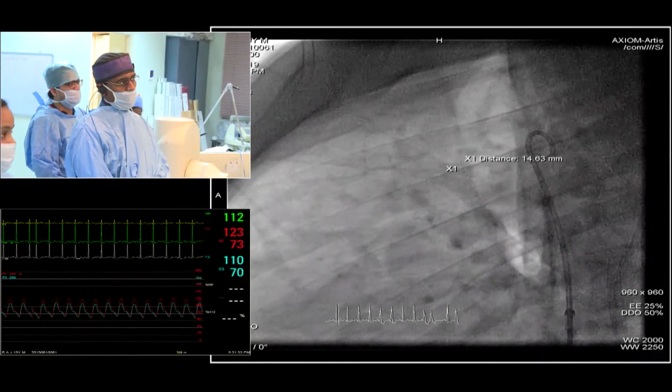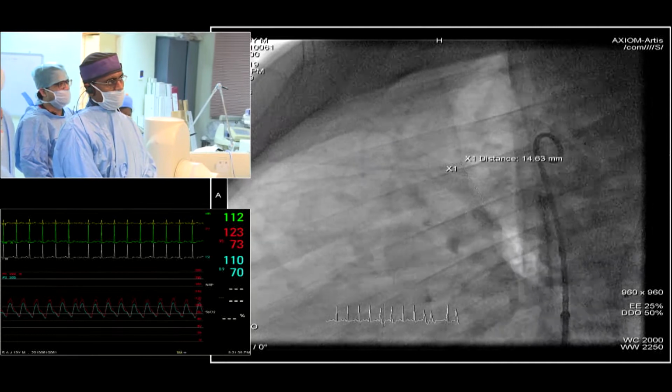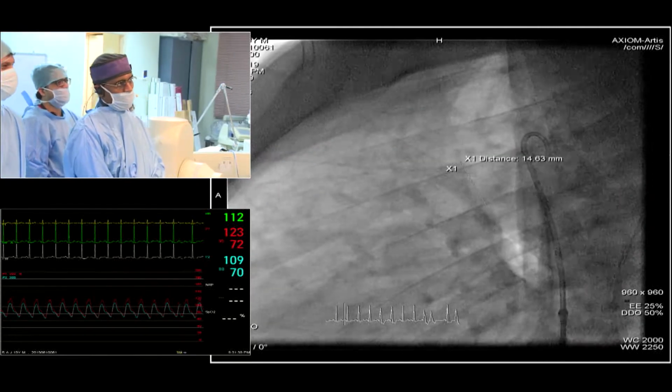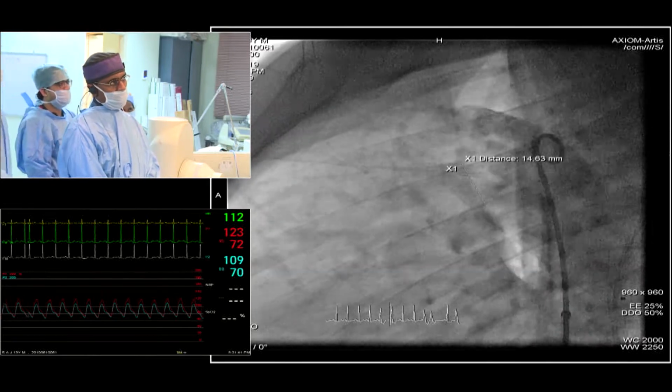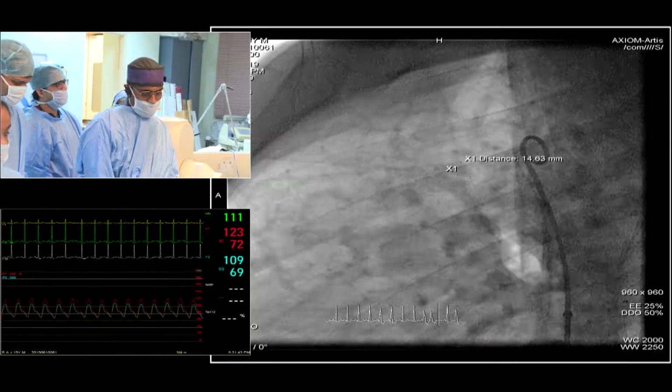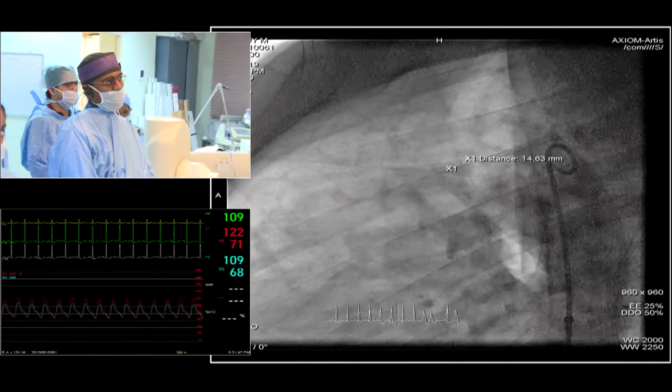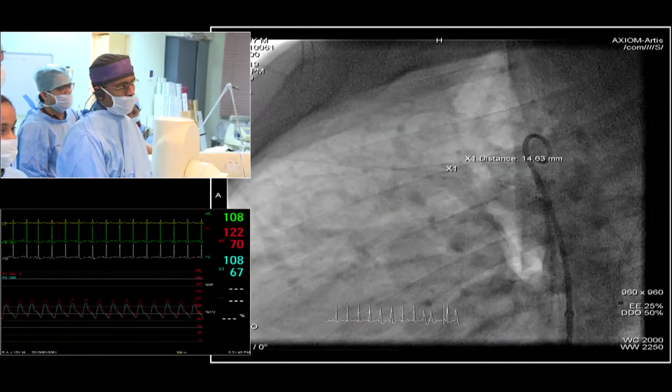Then when you size it, do you measure the pulmonary pressure, and would the diastolic pressure go down? Then you would close it, or would it go up, to avoid it, or would you reduce maybe the duct at first?